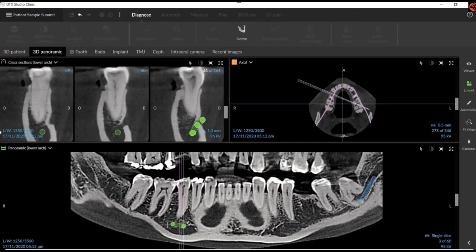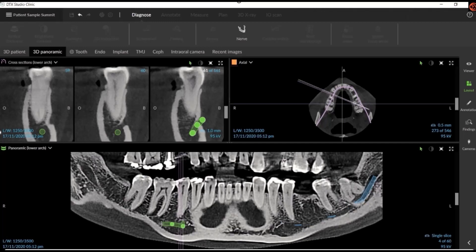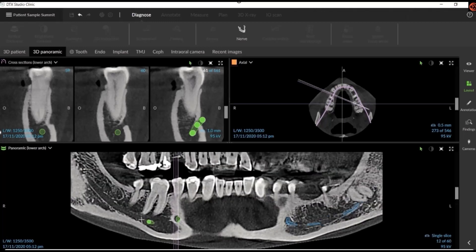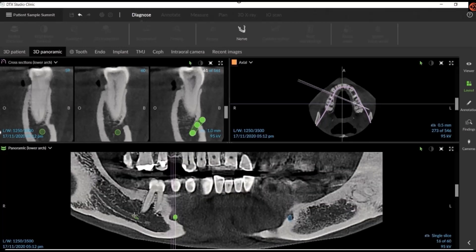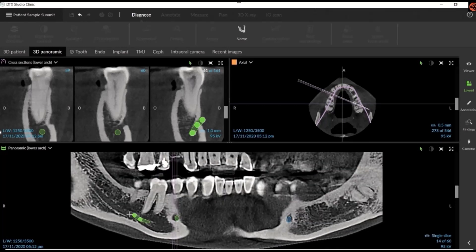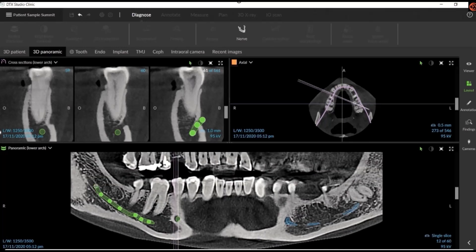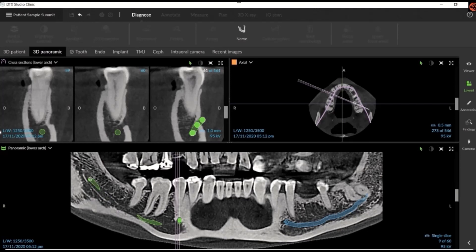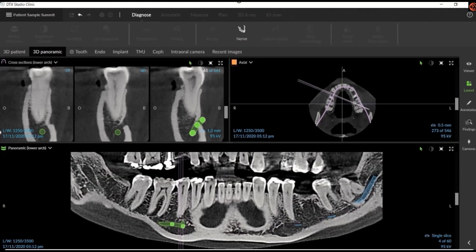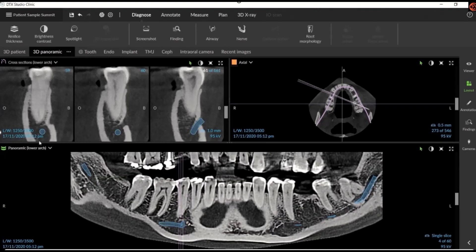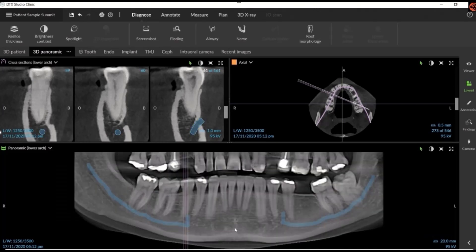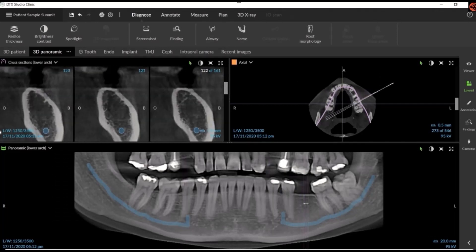DTX will simplify these steps and will automate these manual processes that are necessary in other software. What we now have with DTX is more efficient — we can take all of these steps that you've seen and get to implant placement faster using Magic Assist.